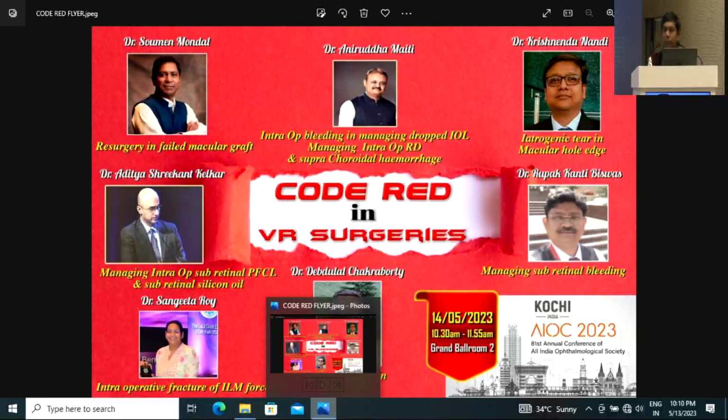Excellent presentation, Dr. Somen. I would like to know why you think there was difficulty in peeling the ILM in this patient particularly? I didn't get you. Can you repeat? Why was there difficulty in ILM peeling? Okay, this is a refractory failed macular hole surgery. So the ILM had already been peeled quite a lot, because this is the second surgery that I'm doing, I had already done an extensive ILM peeling. So I was trying to find remnants of ILM, with which initially I tried to do a free flap. I couldn't. That's why I had to shift back.